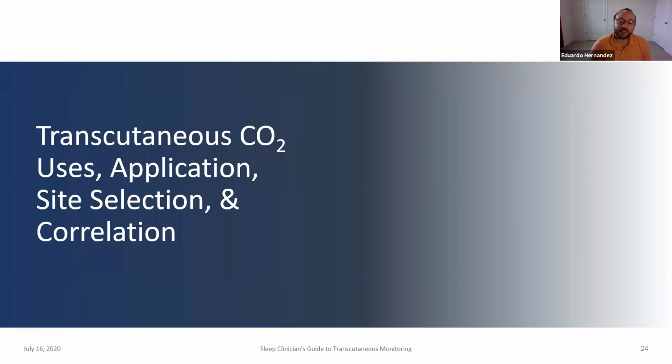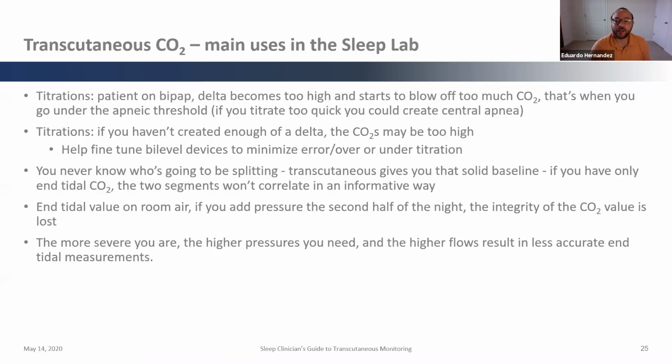And it's important here, we're going to be talking a little bit about the applications, the uses, and the site selection. First, we want to talk about some real life cases where transcutaneous monitoring could offer a potential solution to these aforementioned end tidal problems. For example, in titrations, we've seen this with patients on BiPAP.